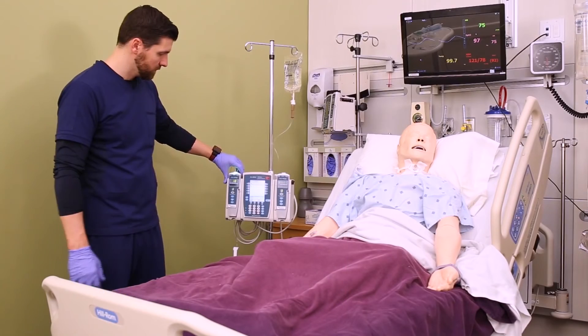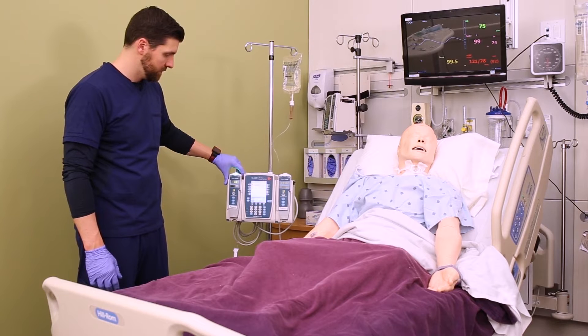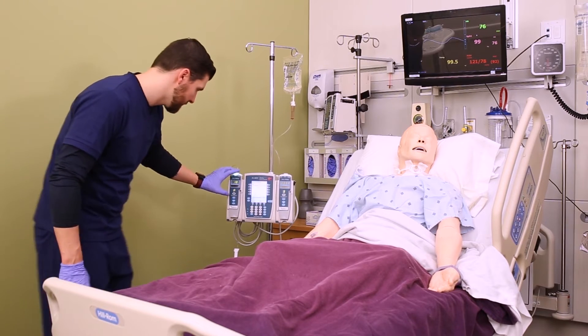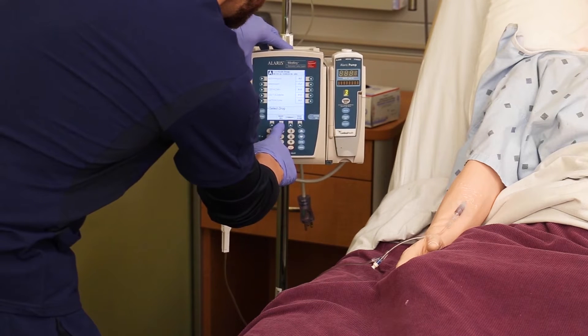Now what we're left with is a partial dose of 0.25 milliliters, or a quarter of a mL, over 15 seconds. Write that down — we're going to use it in a second. This method is a super safe way to do this; all it requires is that you have compatible IV fluids like normal saline infusing.